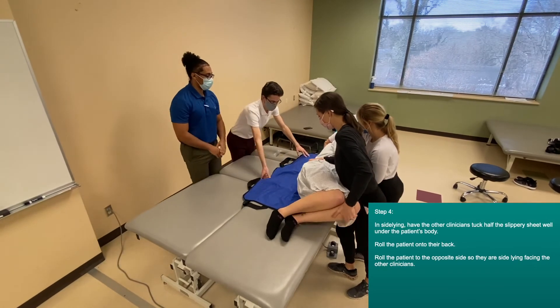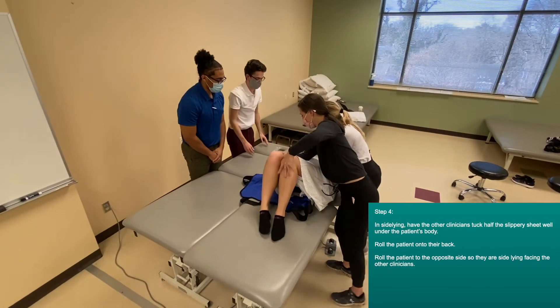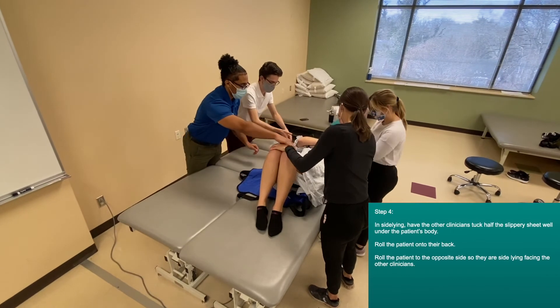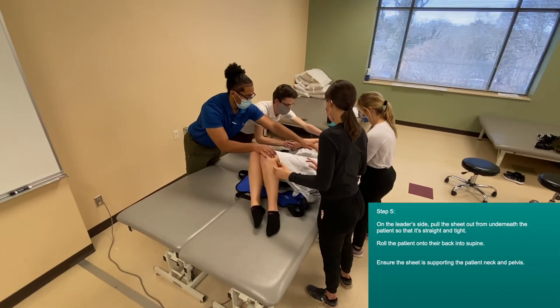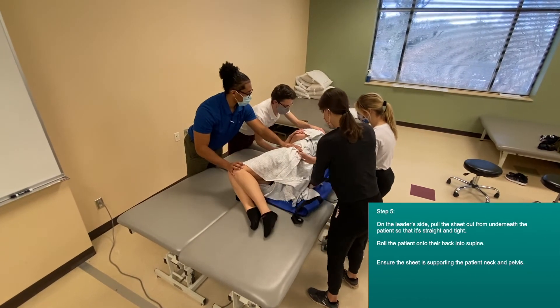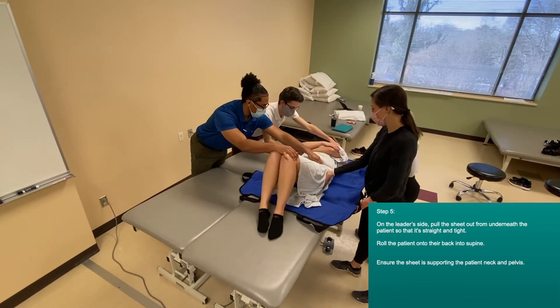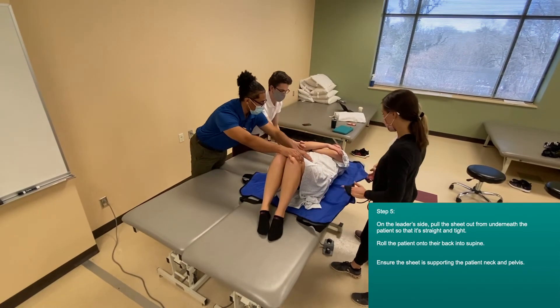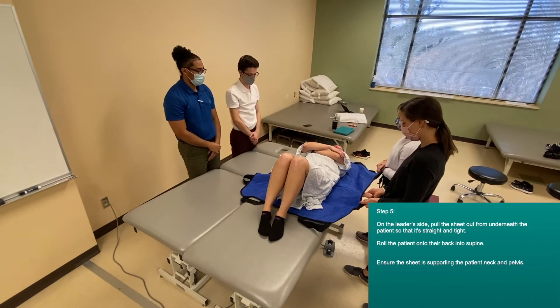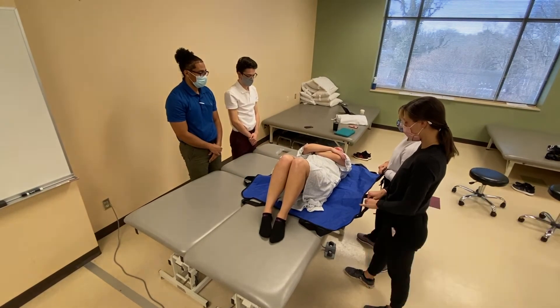Roll the patient onto their back, then roll the patient to the opposite side so they are side lying facing the other clinicians. On the leader side, pull the sheet out from underneath the patient so that it is straight and tight. Roll the patient onto their back into supine and ensure the sheet is supporting the patient's neck and pelvis.